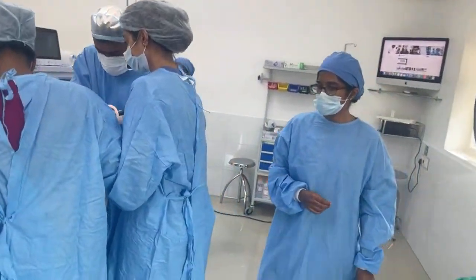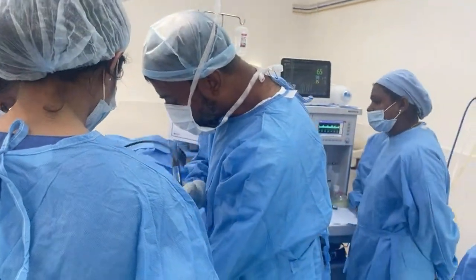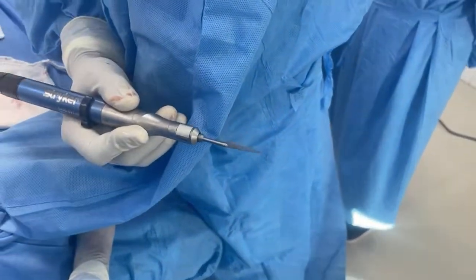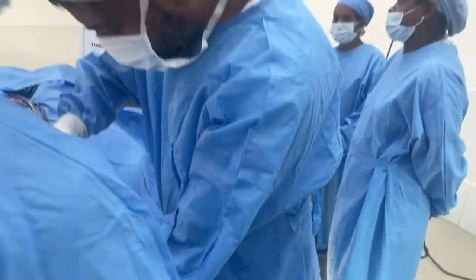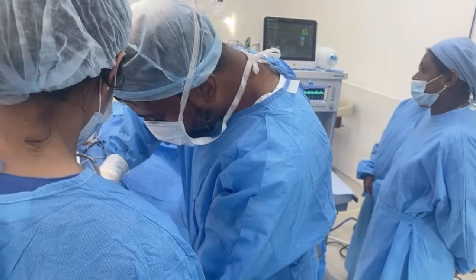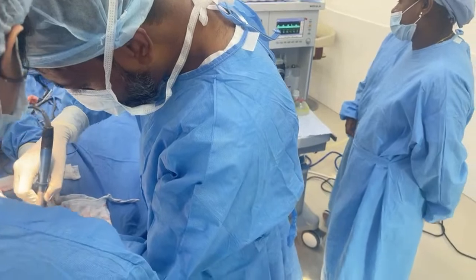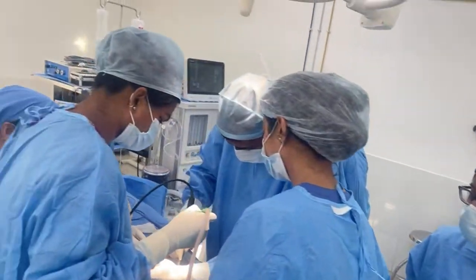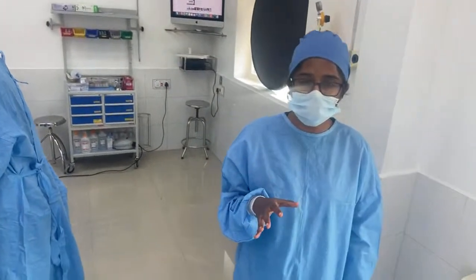So this is the saw. I'm just using this saw right now. You can see this is a saw that we use to cut bone, and it really cuts bone like butter. Trying to show you how quickly it cuts. Put your hand, that's it. You see a lot of support is needed.